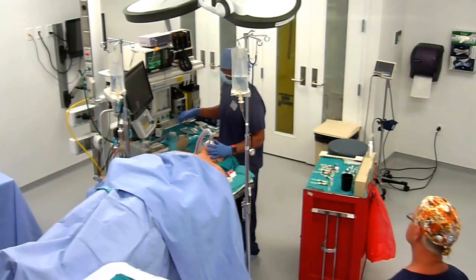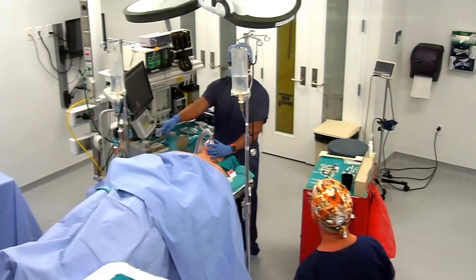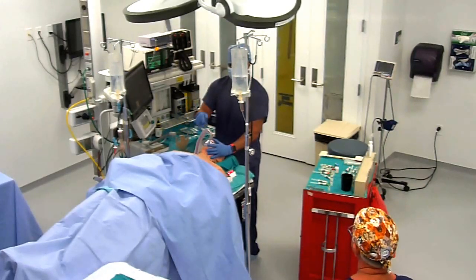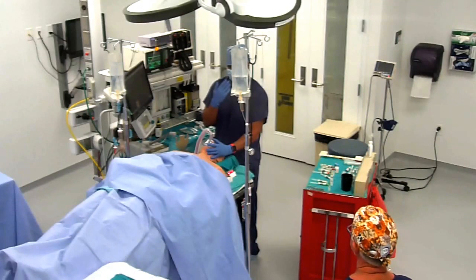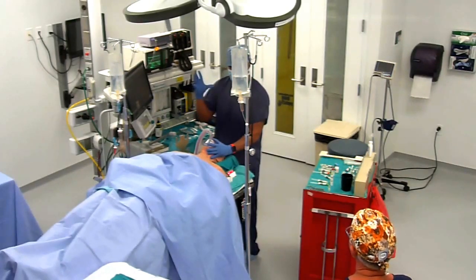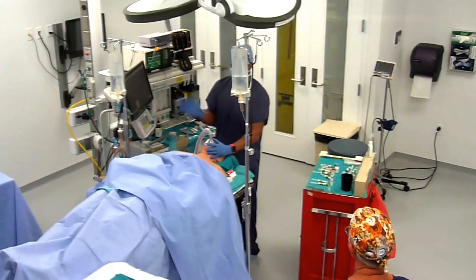So let's say you've taken her to the recovery room. I want to keep the pulse ox on. The first thing I say is the most important thing in the surgery. As I transport her down the hallway, keep my hand on her face or on the face mask, kind of make sure I can still feel breaths moving as I transport her. Equipment, ambu bag, or that thing that I can't remember what it's called.